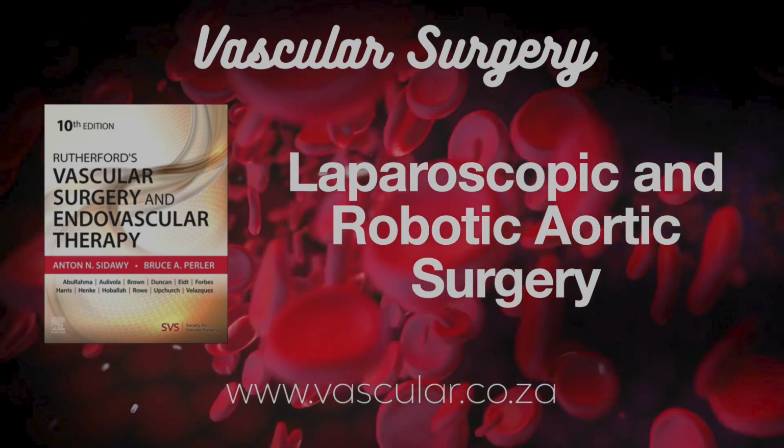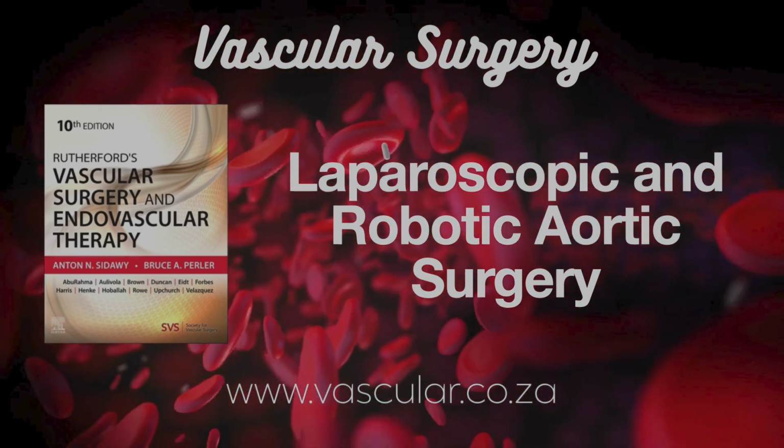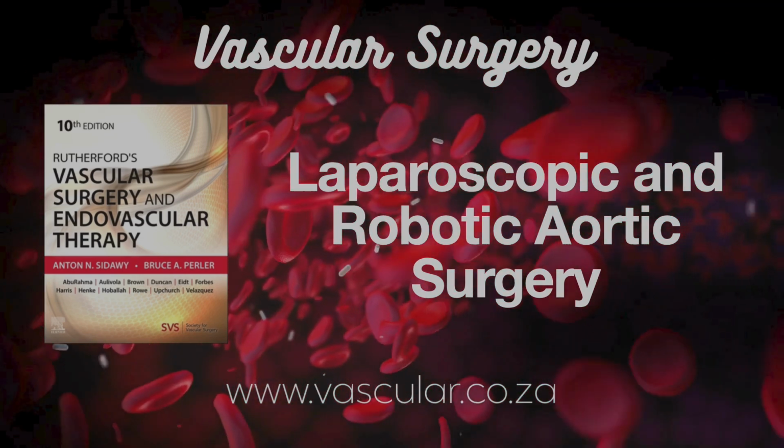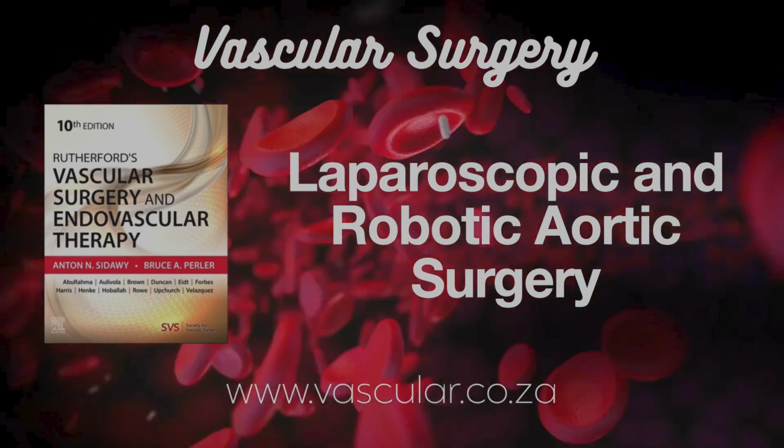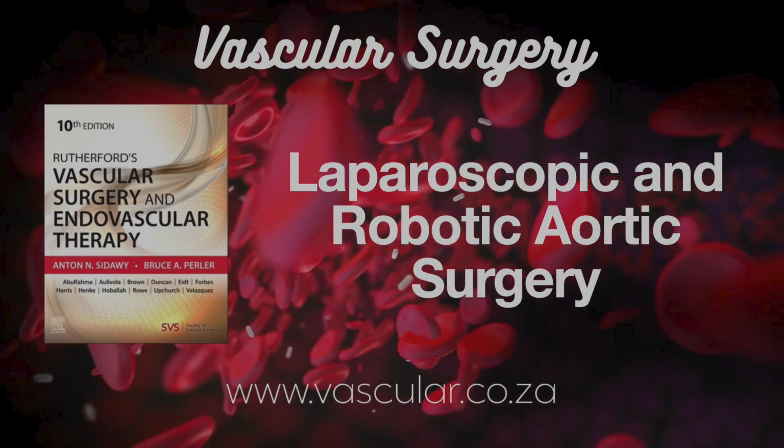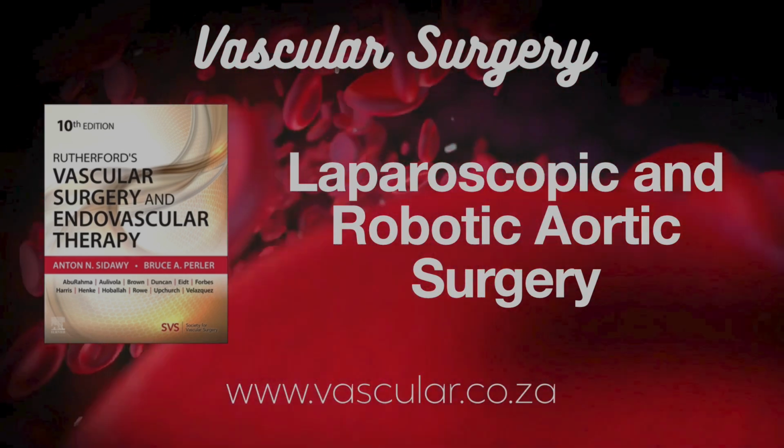Seems that way, yeah. The numbers were roughly 3.4% for TLAS and 1.9% for HALS in AAA repair, but statistically not different enough to say one was definitively riskier based on that data. Okay. And other complications?